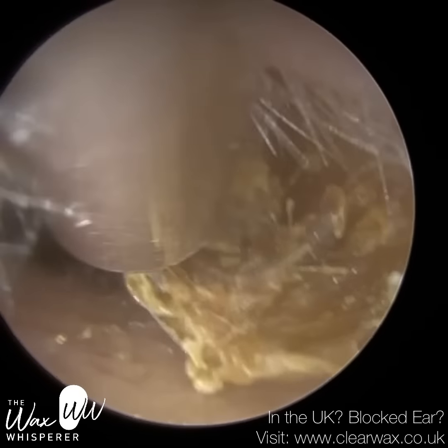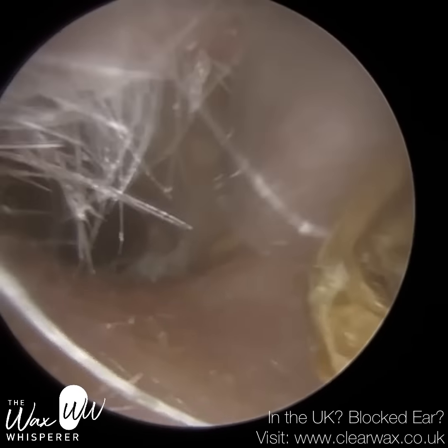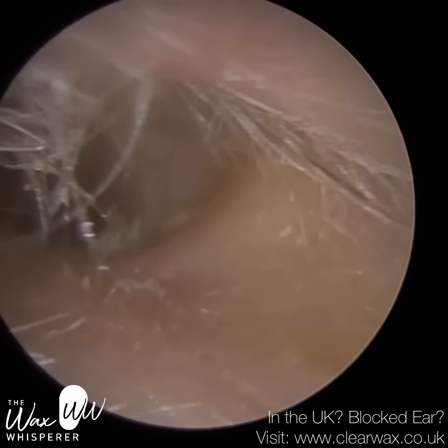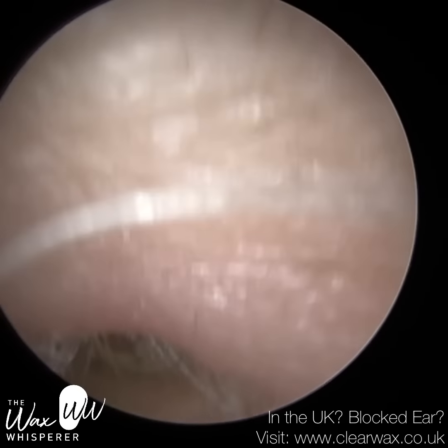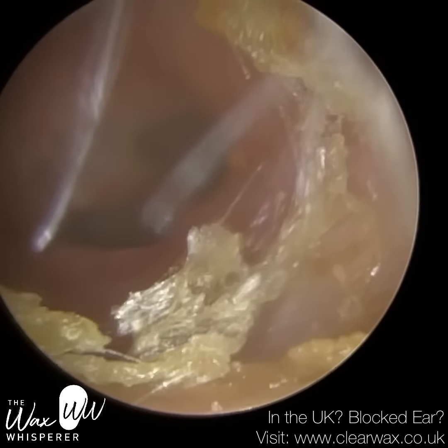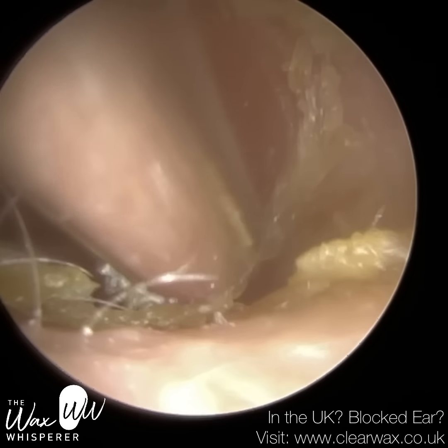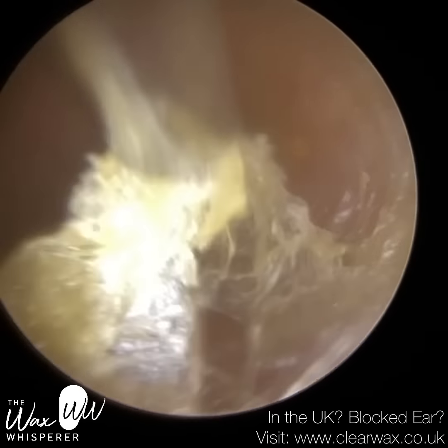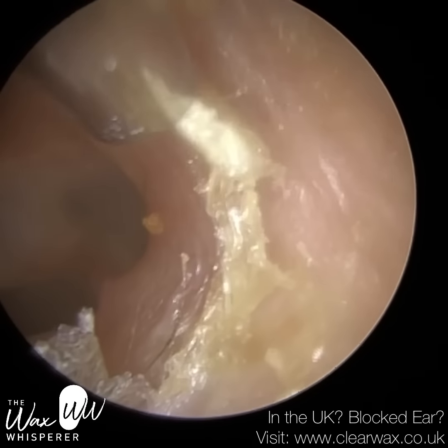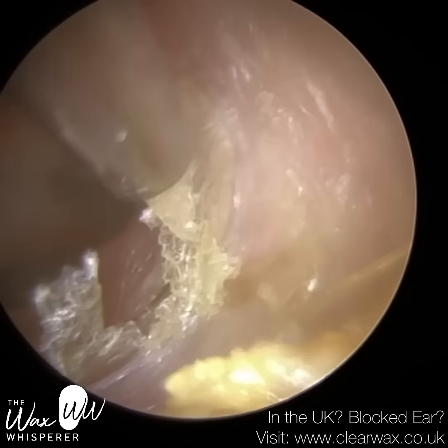The ear over millennia has evolved in such a way that the skin that lines the ear canal, as it dies and is replaced by a new layer of skin, that dead layer of skin has the unique property to migrate sideways out of the ear, almost like a conveyor belt, and we call that the epithelial migration. And it all commences at the centre of the eardrum, where the hammer bone is attached. You'll see it in a moment. It's like a little bullseye. We call that the umbo.